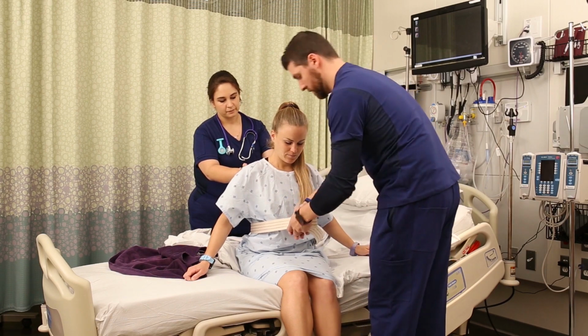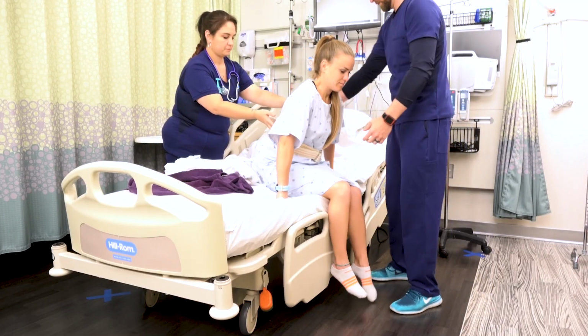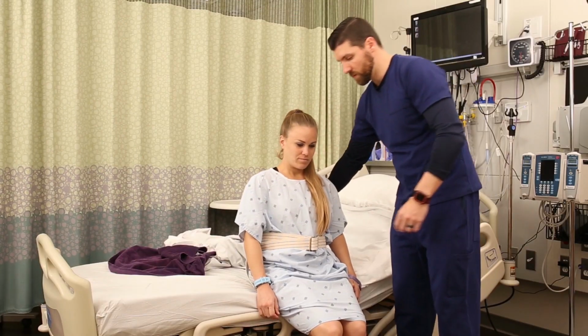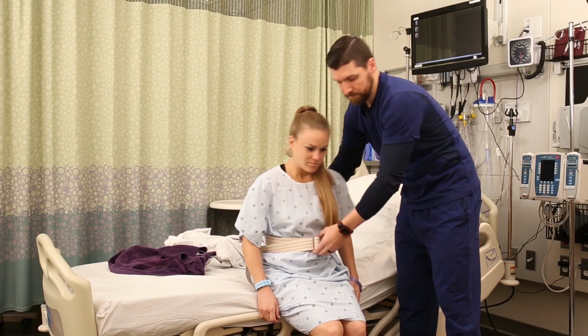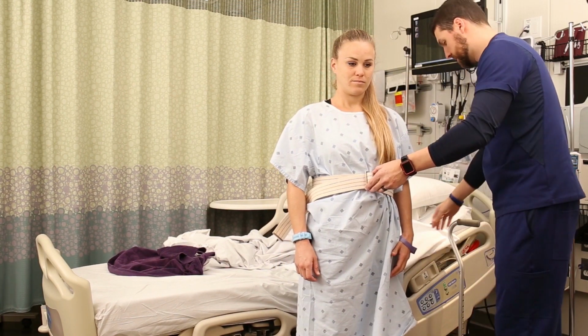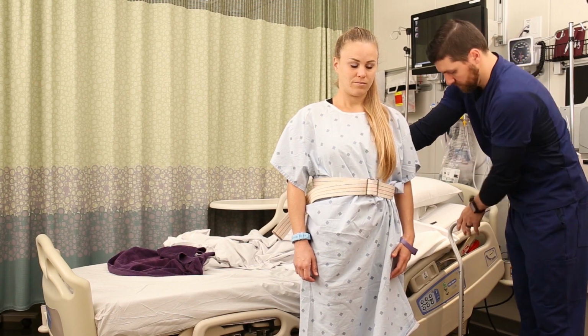So once you're ready and you have your gait belt on, have your patient scoot their hips forward till their feet are touching the ground or a step stool, and you'll have them rock back and forth a few times for momentum and stand up tall on 3, pushing with their legs and keeping their head up. Now, once they're up, you can move on to the next task.